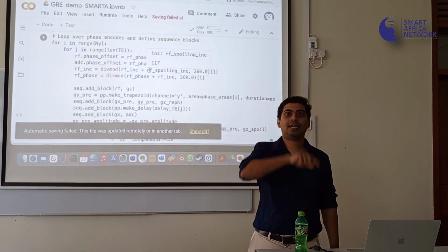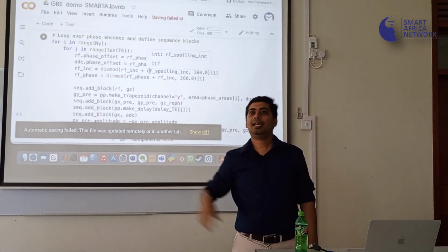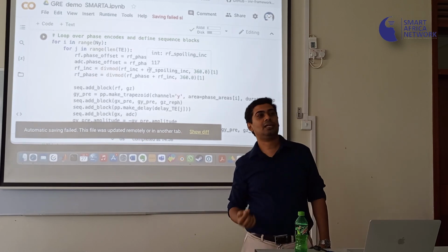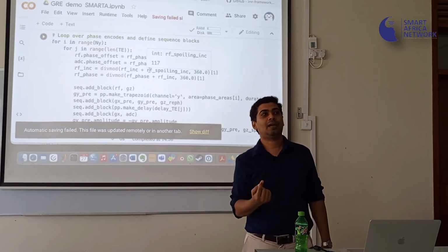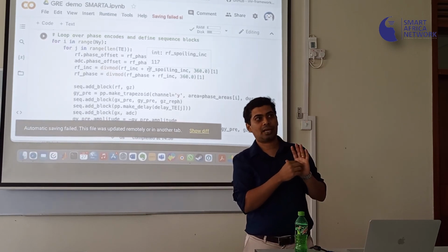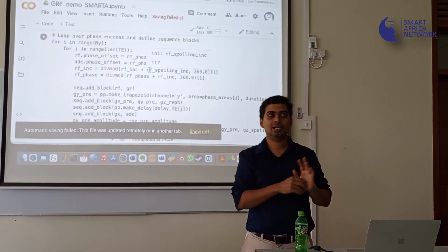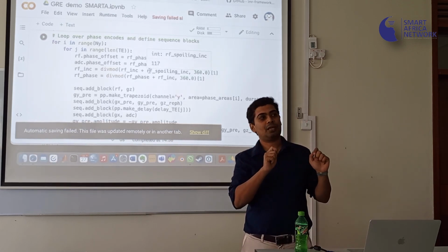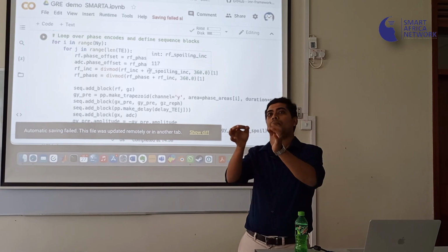Meaning, if there is a sine wave with 50 Hz and you captured that with an MR scanner, you're going to see a signal at 50 Hz in the data you acquired. So it's going to say, oh, there is a signal with 50 Hz. There might be another signal with 120 Hz. So for every such frequency, you get 1 point.